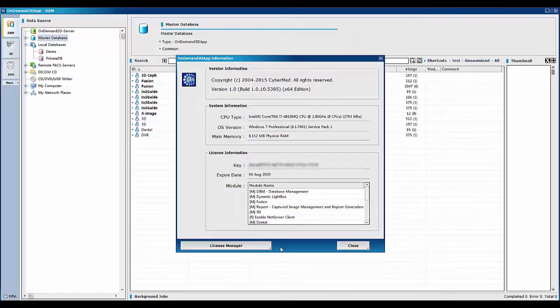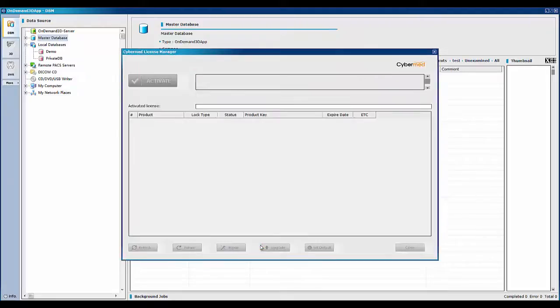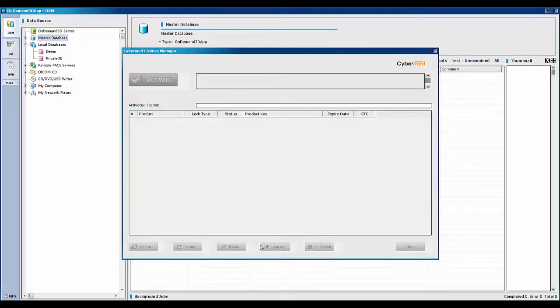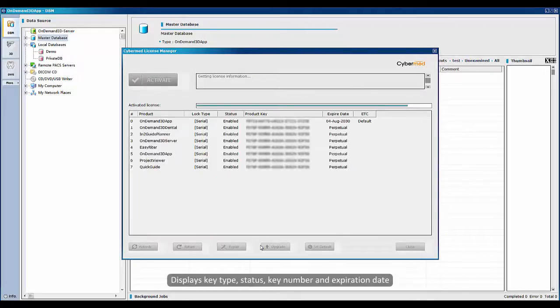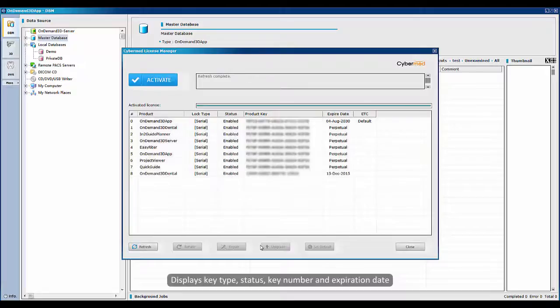To further see the details of your license or to manage it, click on the license manager button. CyberMed license manager searches for the license information used on a workstation and displays key type, status, key number, and expiration date.